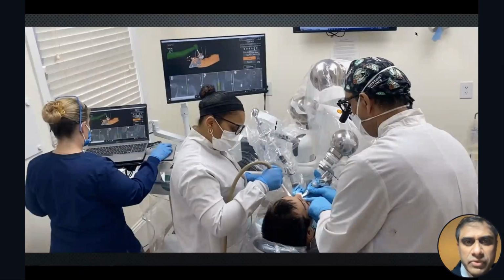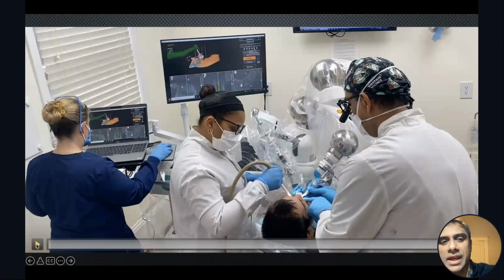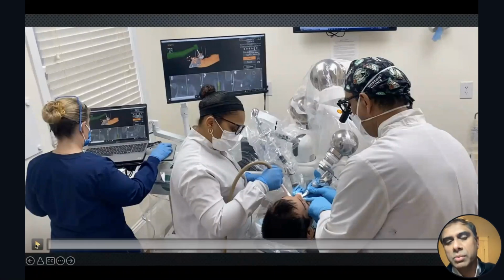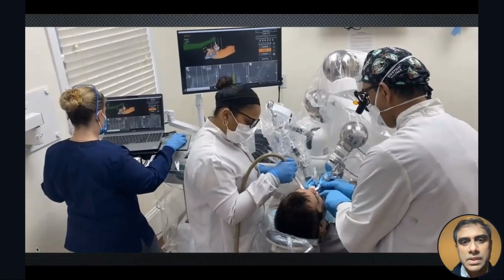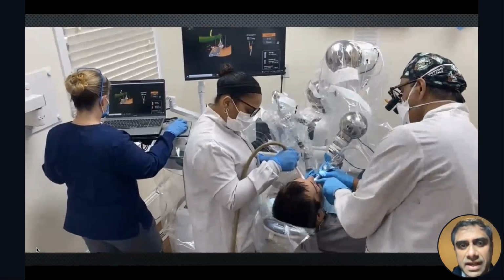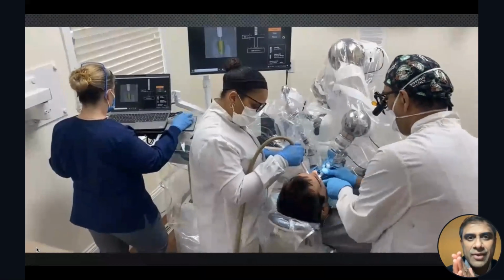In this video, you can see on the top big screen the green handpiece. It's telling us that I'm still not in the right position. It's telling me to change by about, say, 5, 6, 7, 11 degrees, whatever it is. And my assistant is also telling me, hey, doc, move more towards the mesial, more towards the buccal, more towards the distal. So you can see there's a little angulation there. Now it merged together. It confirmed that I was in the right position.